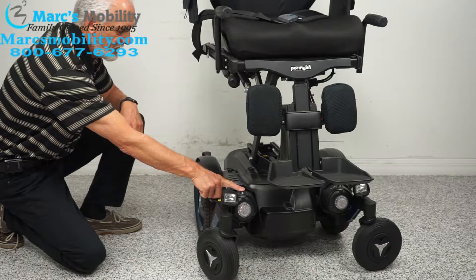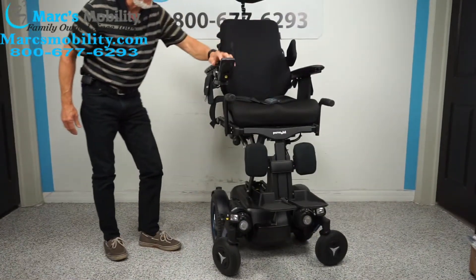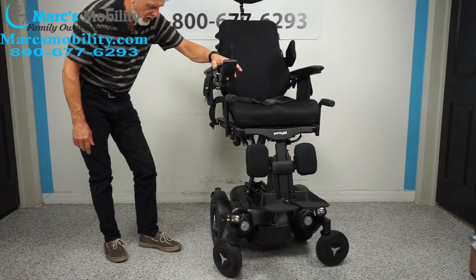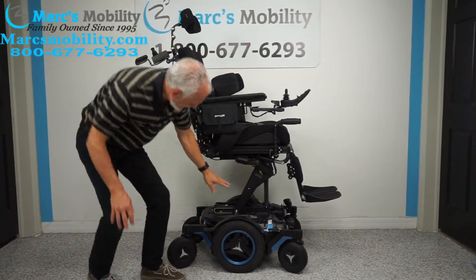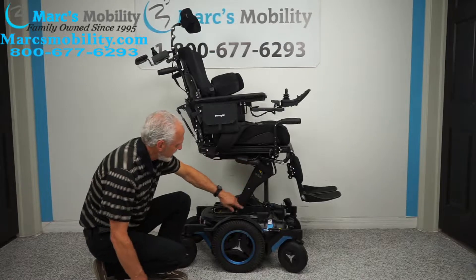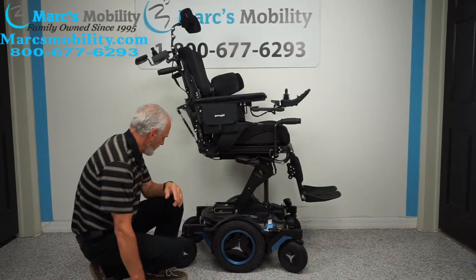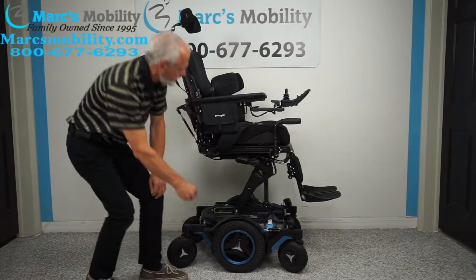On the M5, this is where your levers are for neutral, so you need to remember that — you might have to use this one day. We'll turn the power back on and give it a second to reset. You can see the actuator right here for the seat lift.